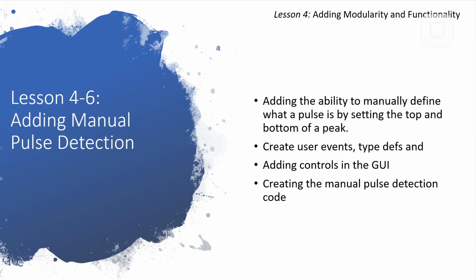Currently we're using a simple get the frequency VI from LabVIEW, and it works quite well, but I know there is a better way of making it, but it's more complicated and it's not that much better. The reason we're adding it partially because we want a better peak detection, but also to show how easy it is to add extra functionality to an application like this.